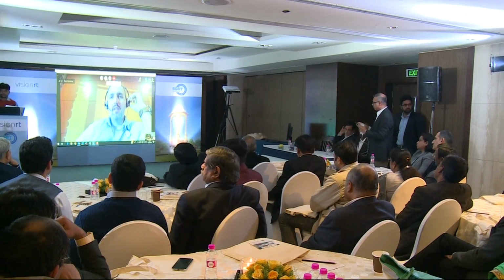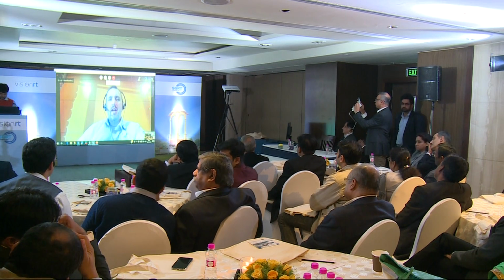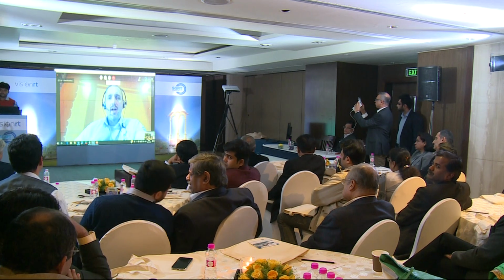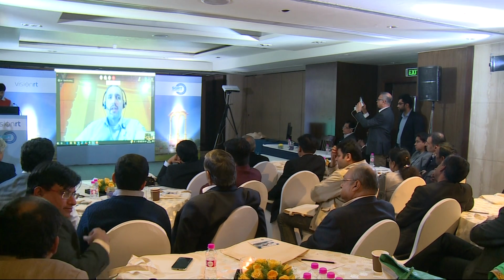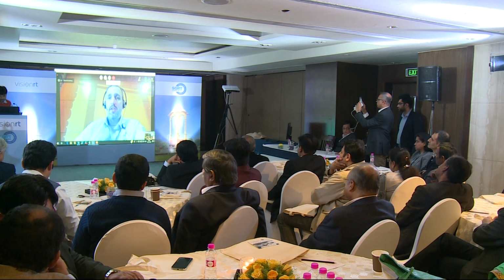Well, as far as addressing the first question, I don't think SGRT will completely replace IGRT as far as image-based technologies because they address different problems. Like I said, IGRT is a technology that moves the patient as a rigid body. There's no IGRT currently on the market that addresses a patient as a moving, independently motion-based creature. So SGRT kind of bridges that gap for IGRT.